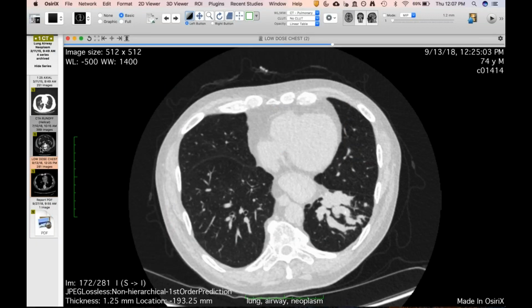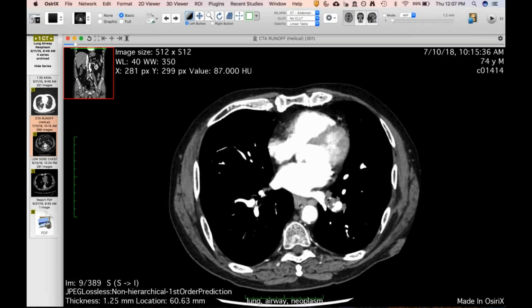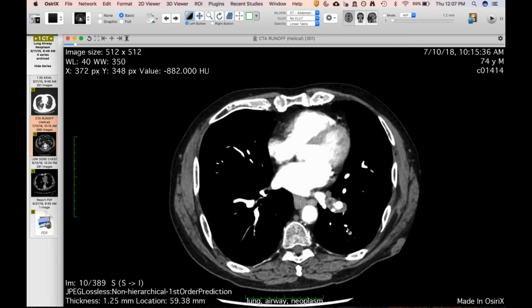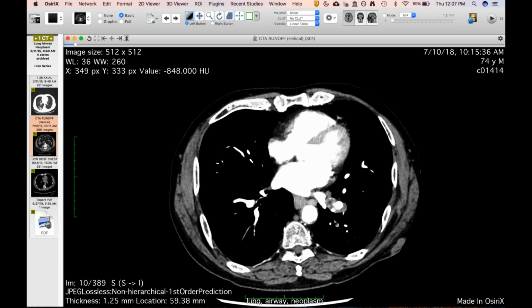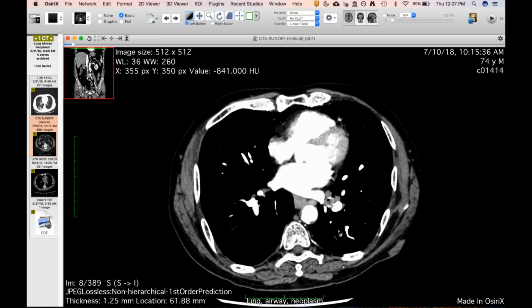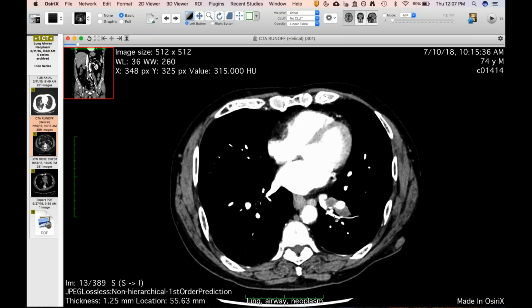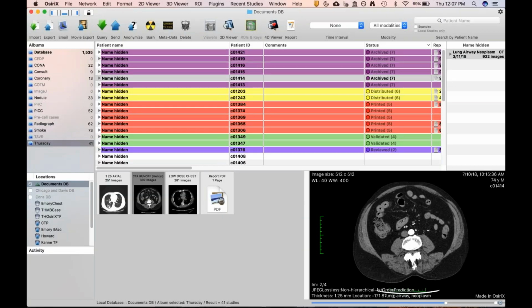And so I think that probably on this abdomen pelvis CT, this is the object right here with that more fat attenuation like you often see with beans or vegetable food stuff, whatever. But no mass, just another foreign body obstructing in somebody that was aspirating.